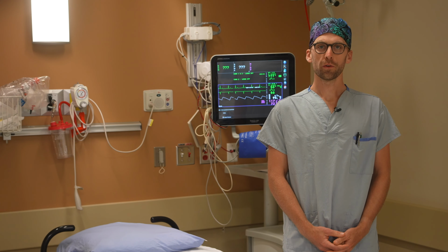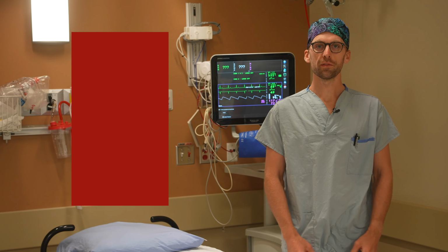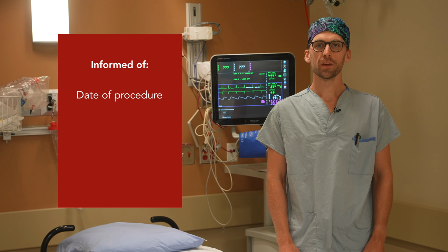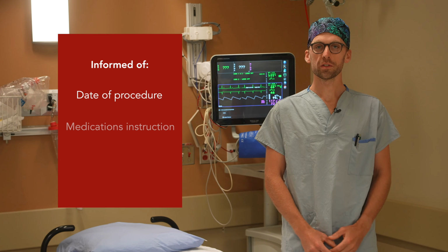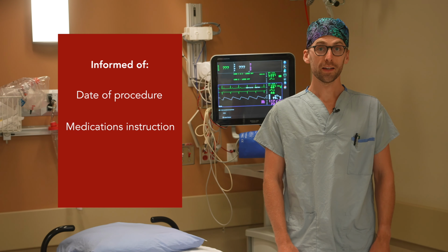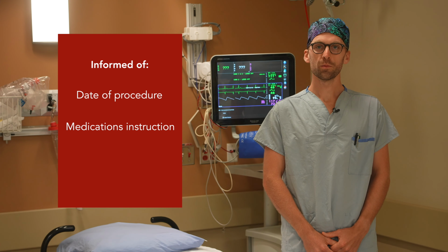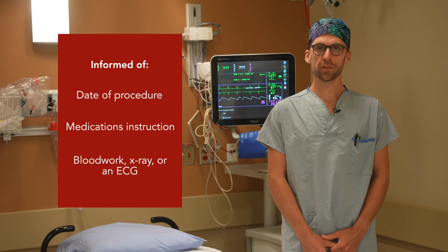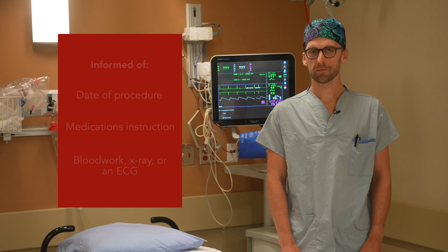How do I prepare? If you're coming for your procedure from home, you will receive a phone call from the cath lab booking clerk, who will give you the date of your procedure. You may also receive a call from a nurse if you need specific instructions about your medications. As a reminder, the booking clerk will let you know if you require any tests prior to your angiogram. These may include blood work, an X-ray, or an ECG. Please ensure these are complete before your procedure date.